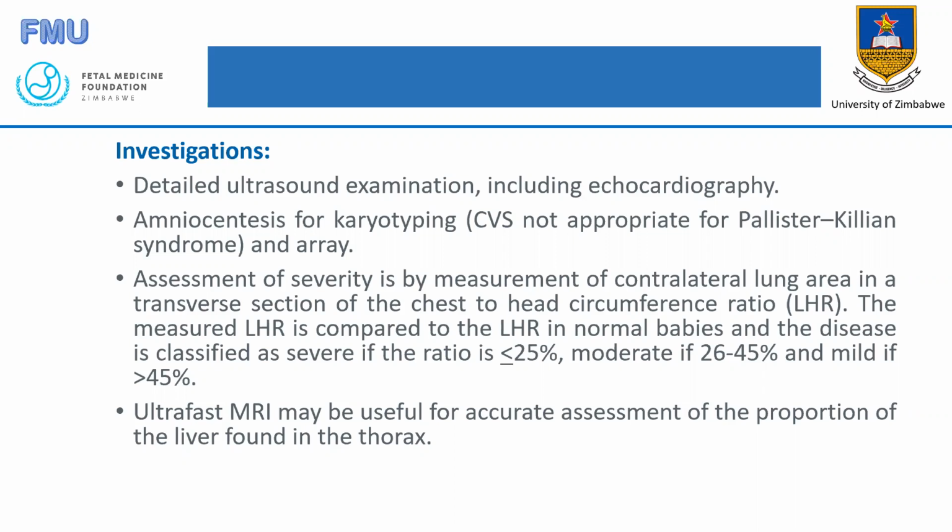Then ultra-fast MRI may be useful for accurate assessment of the proportion of the liver found in the thorax. And so these lung-head ratios are the basis for counselling on the pregnancy care plan, to say, do we continue or do we offer the couple expectant management as a viable option, or do we offer them termination of pregnancy as the most viable option for them? This is based on the lung-head ratio.